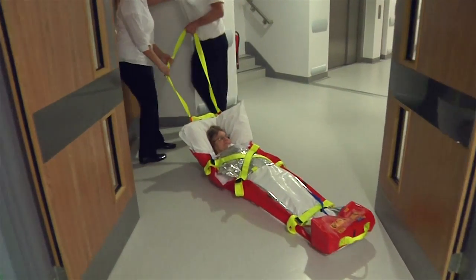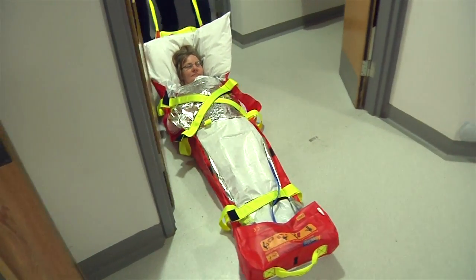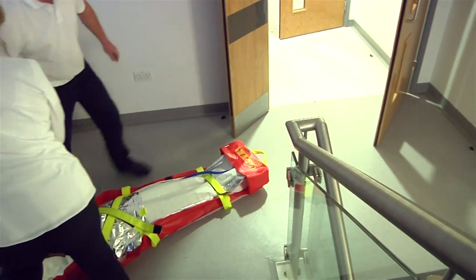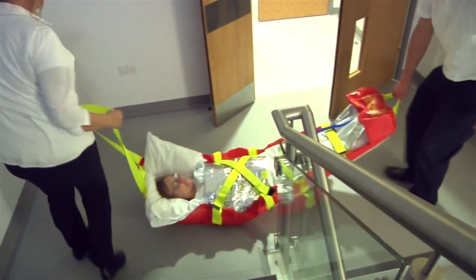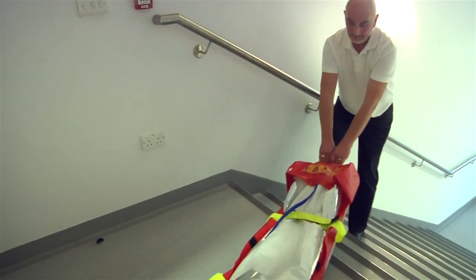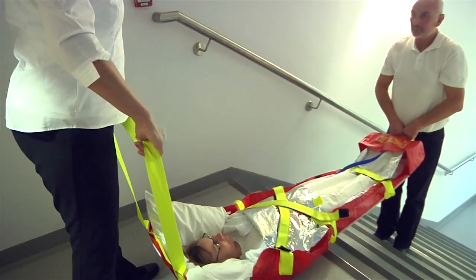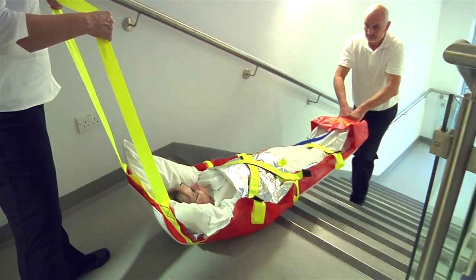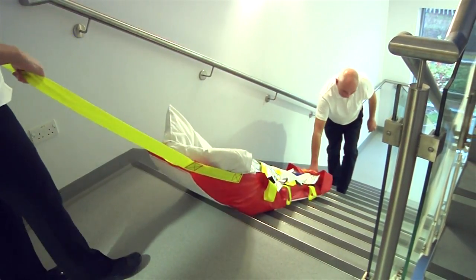However, it is vital that the patient approaches the stairs feet first, so be careful to ensure that turning the AlbacMat around in a narrow corridor is not required to achieve this feet first position. With one person at each end of the AlbacMat, the patient can be moved down the stairs. It is very important that the person at the foot end keeps the AlbacMat as straight as possible until the upper part of the body has come over the top step. This will help to prevent excessive bending of the patient's hip and pelvic area.